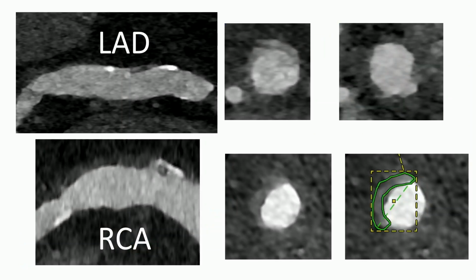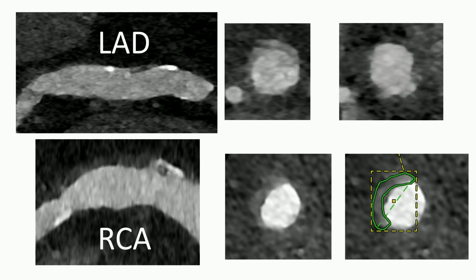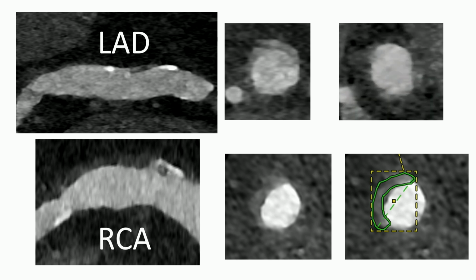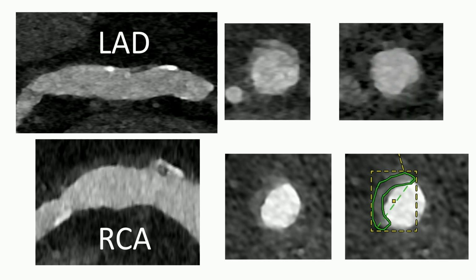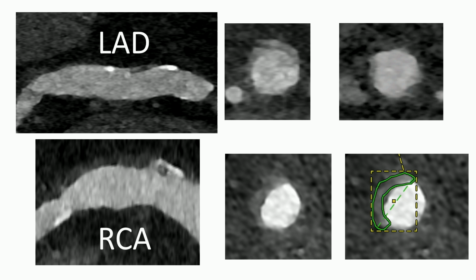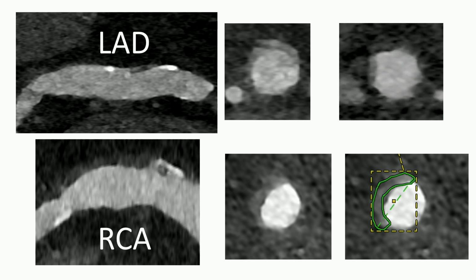And I'm going to show you now just my own images that I snapshot here to convince everyone who doubts if there's really that much non-calcified plaque. On the top here is the LAD on long axis, and you can see on the short axis, even on this screen, which is not super high resolution, where the arrow I'm showing is extensive non-calcified plaque around the vessel. You can see that as we're going down the LAD.